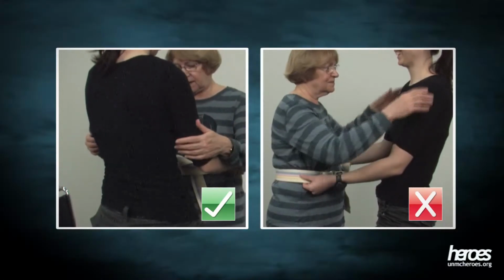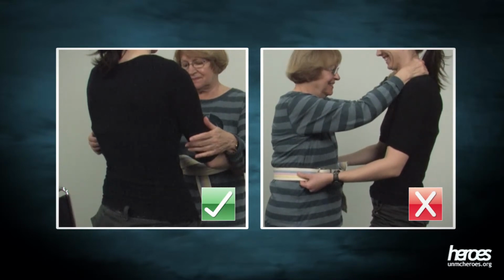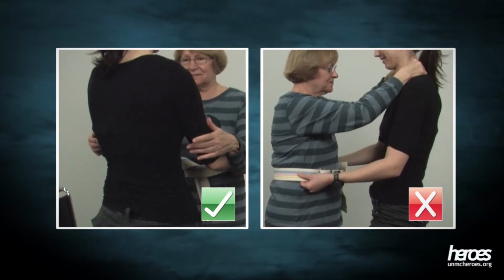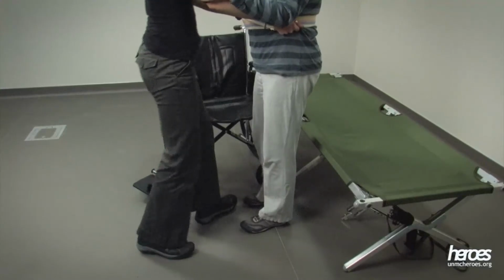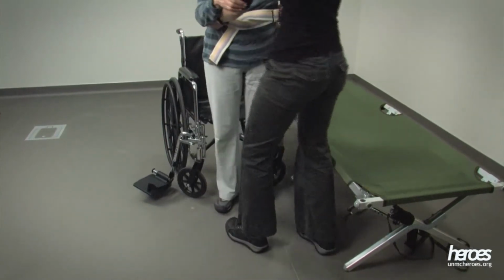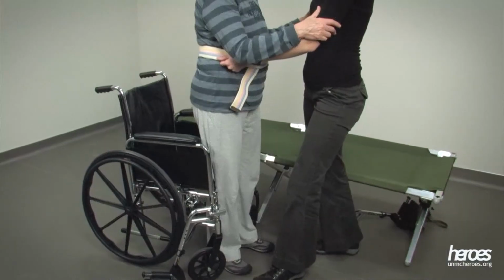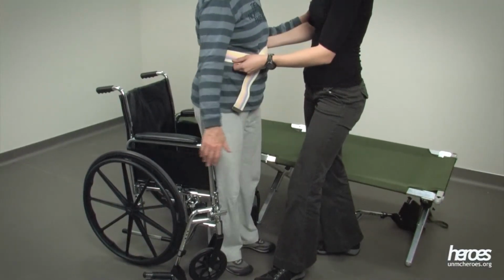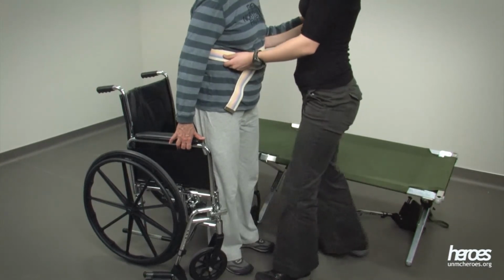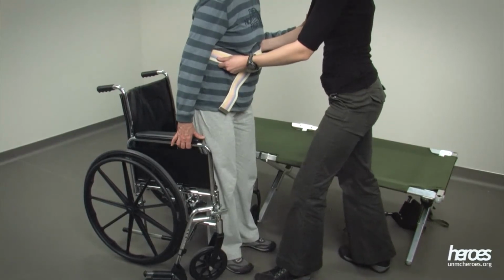Once the individual is standing, have them place their hands around your arms just above the elbows for support. Do not let the individual place their hands around your neck for support. Then have the individual pivot or shuffle their feet toward the wheelchair. When the individual feels the back of both their legs touching the wheelchair, have them reach back with one or both hands for the armrest of the wheelchair as they slowly lower to the sitting position.